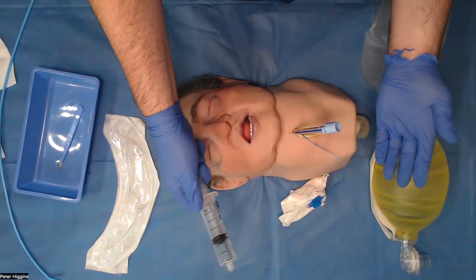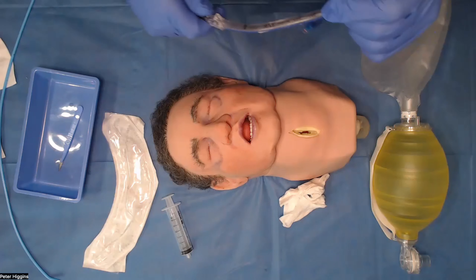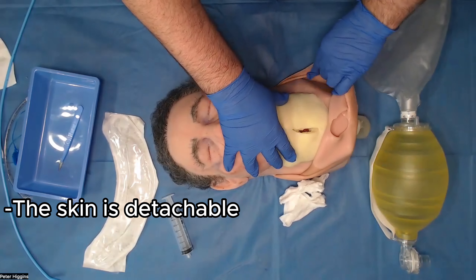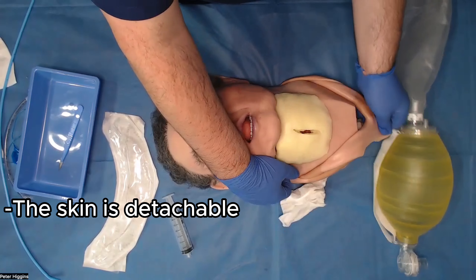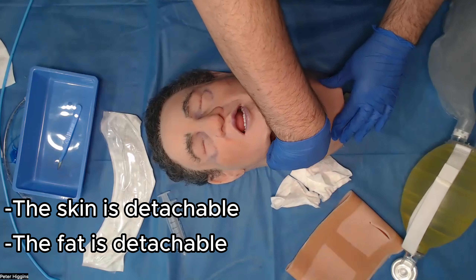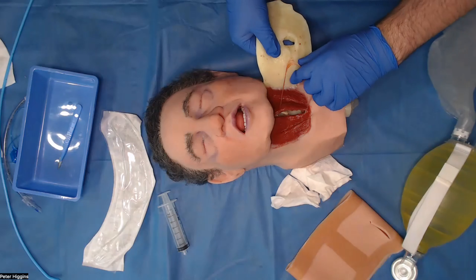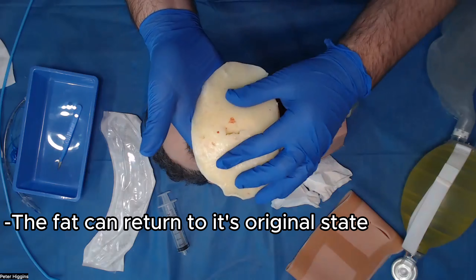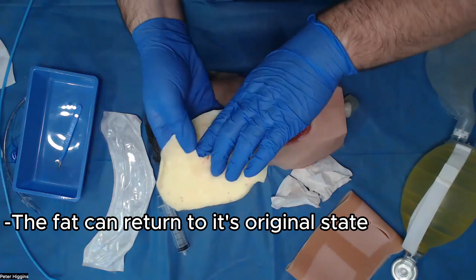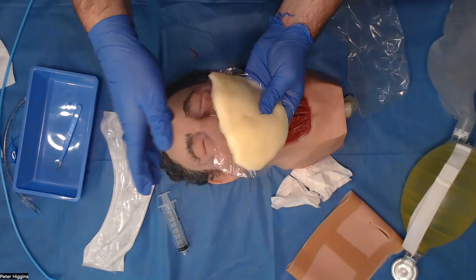To disassemble, just going to deflate the cuff. Pull the tube. You can roll the skin down. Take off your fatty tissue. With the fatty tissue, once it's been removed, you can smush it all back together — looks like you were never there. Keep the plastic wrapper.